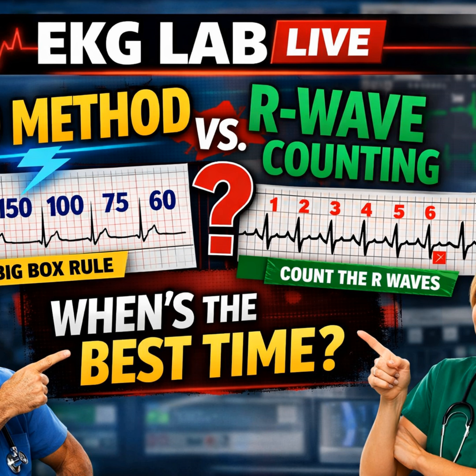If I use your strip method, I count 14 or 15 spikes. I get a rate of 140 or 150, but I don't get that click of recognition. The math, the precision, it guides my eye to the diagnosis. That's a compelling argument for flutter, I'll give you that.